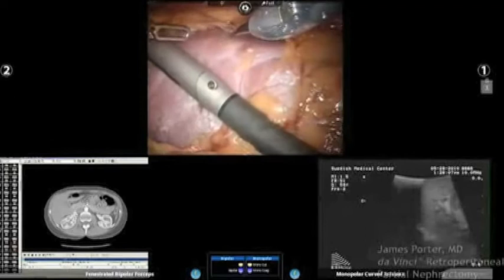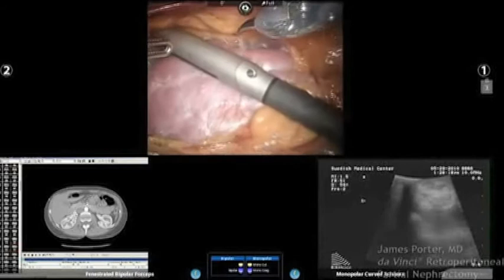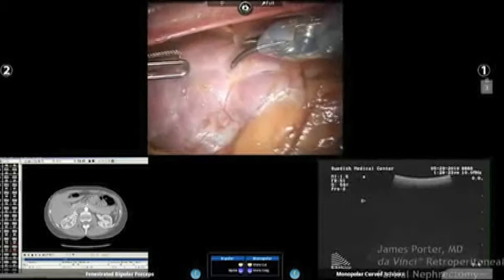And I think this demonstrates the importance of the ultrasound. I think a lot of people looking at the original place you were looking with that ultrasound would have thought that was the tumor. Yeah. No, that's tumor right there. This really highlights it. Very bright tumor. Okay, come on. Nance. Yep.